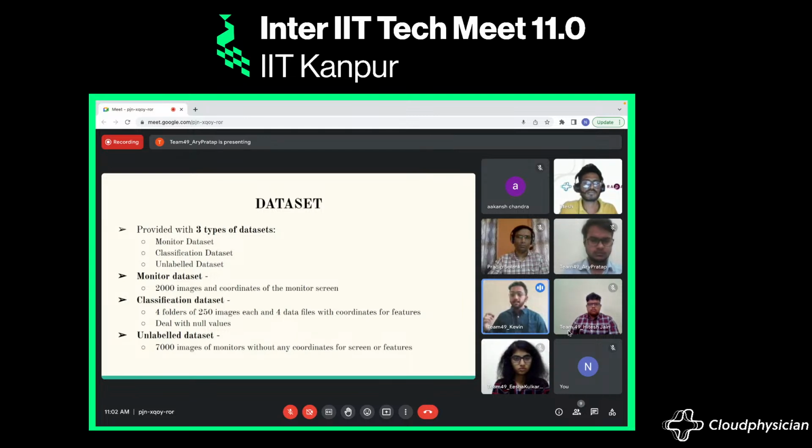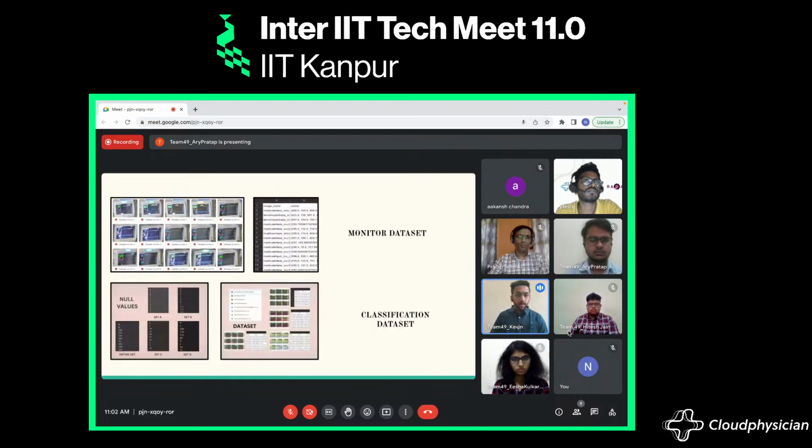The unlabeled data set consisted of 7,000 images, for which we weren't given the coordinates. Let's have a look at the null values that we received from all 4 sets: set A, set B, set C, and set D. In the first image, you could see where we are segmenting the monitor screens.